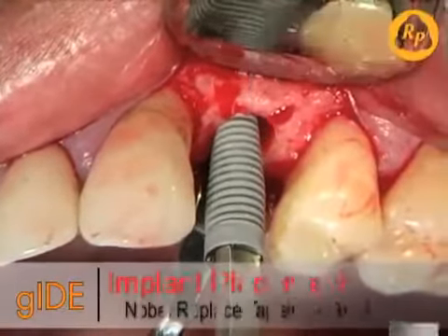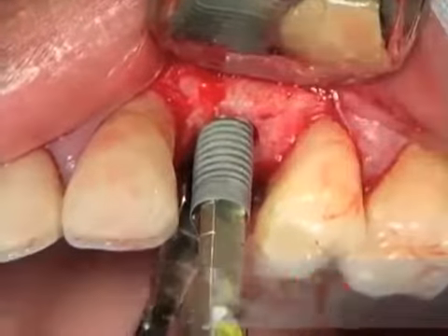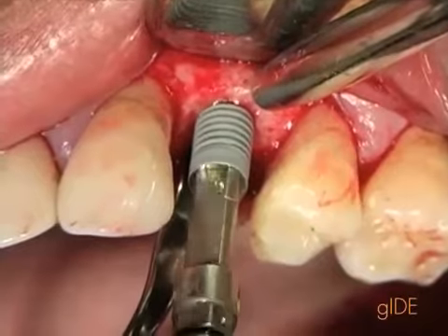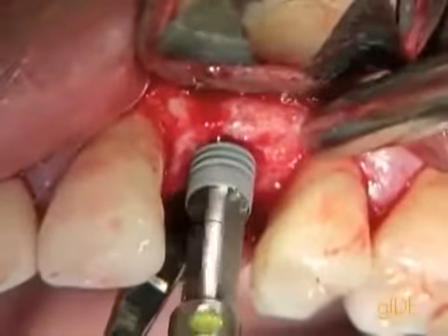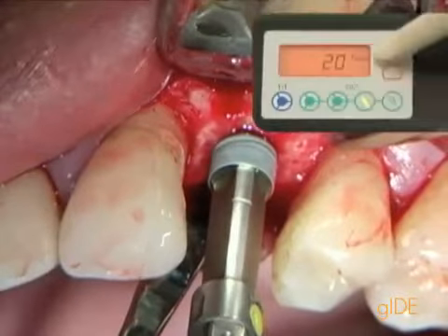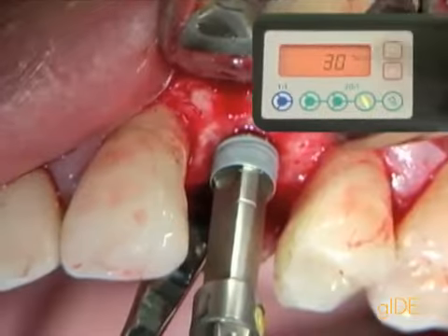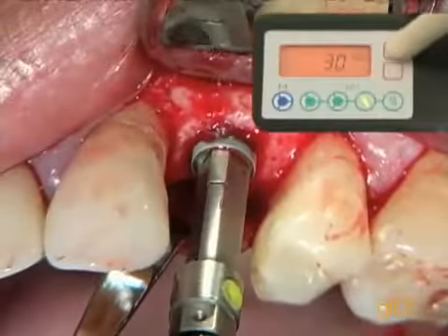The first torque used is 20 Newton centimeters, which will now bring the implant into position. At 20 Newton it stopped, and we're increasing the torque to 30 Newton and continuing with the positioning of the implant.